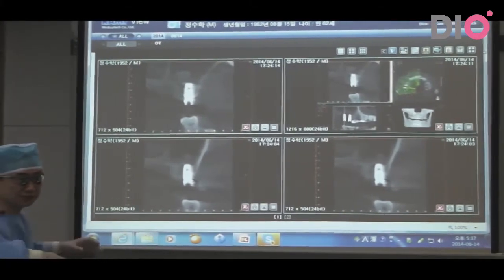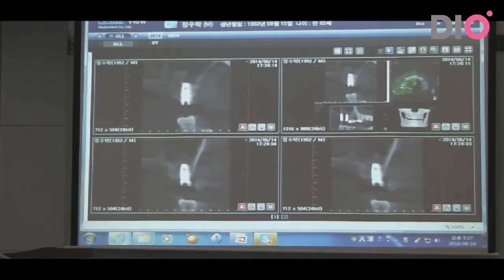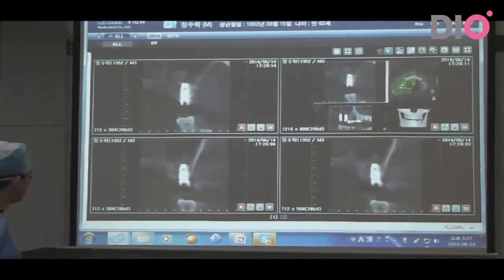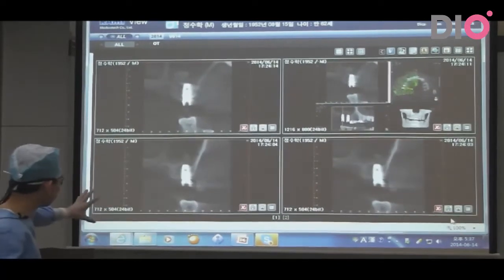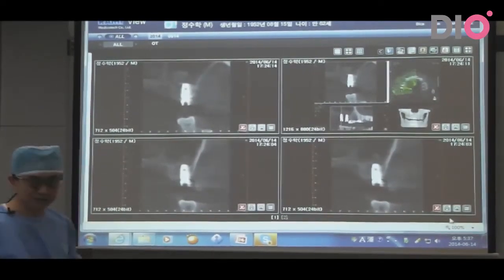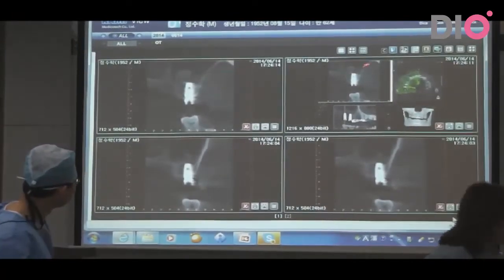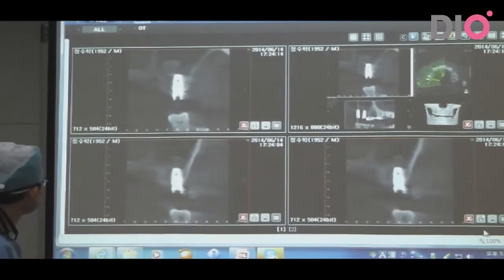And then next slide, please. This one? Okay, this is the X-ray of the other implants. You can see also the graft material above the implants.